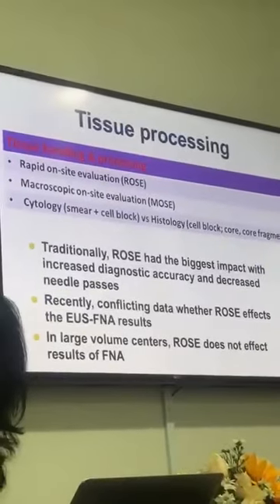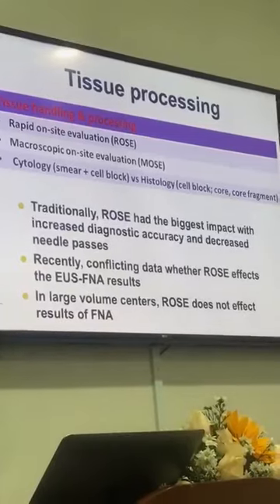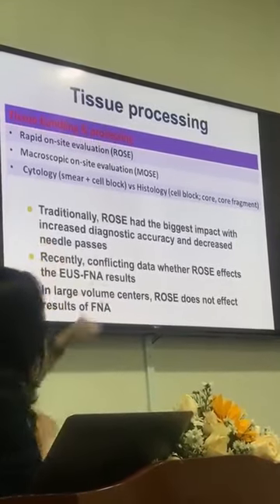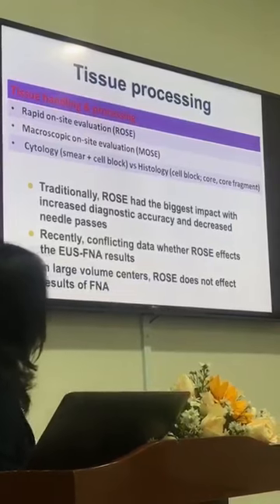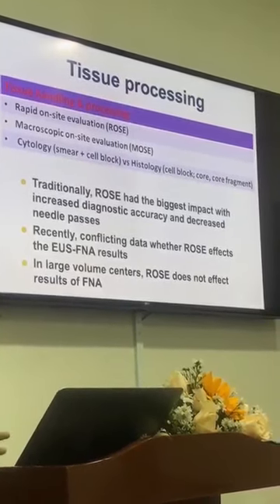Last but not least, tissue processing. I introduced to you ROSE, MOSE, cytology, and histology. So traditionally, ROSE had the biggest impact to increase the diagnostic yield. That's the old data.